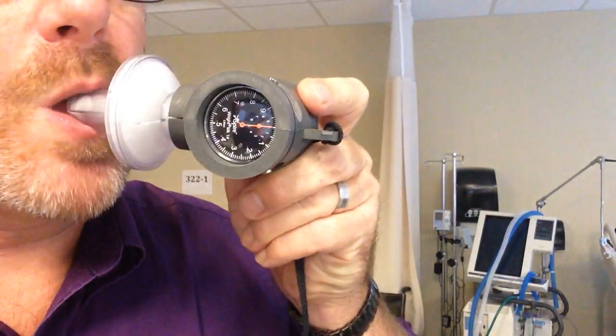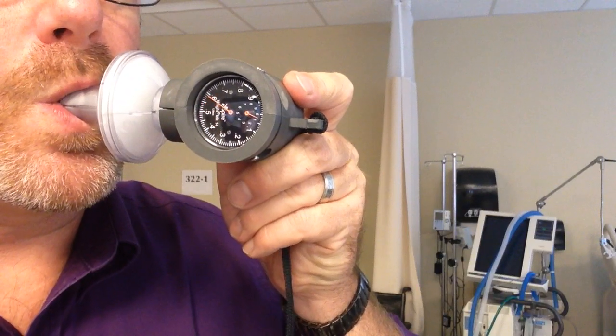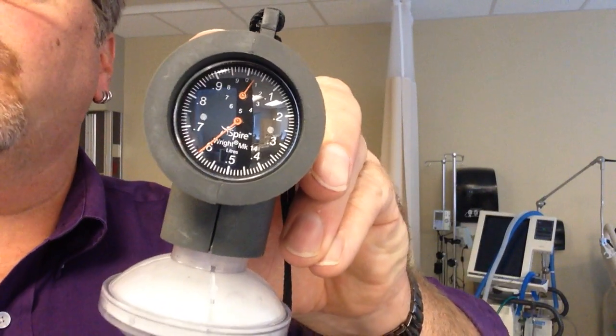Also, for the tidal volume, if you're just doing tidal volume, just a normal breath out. Do it one more time. As you can see, I'm breathing at about 600 cc's.